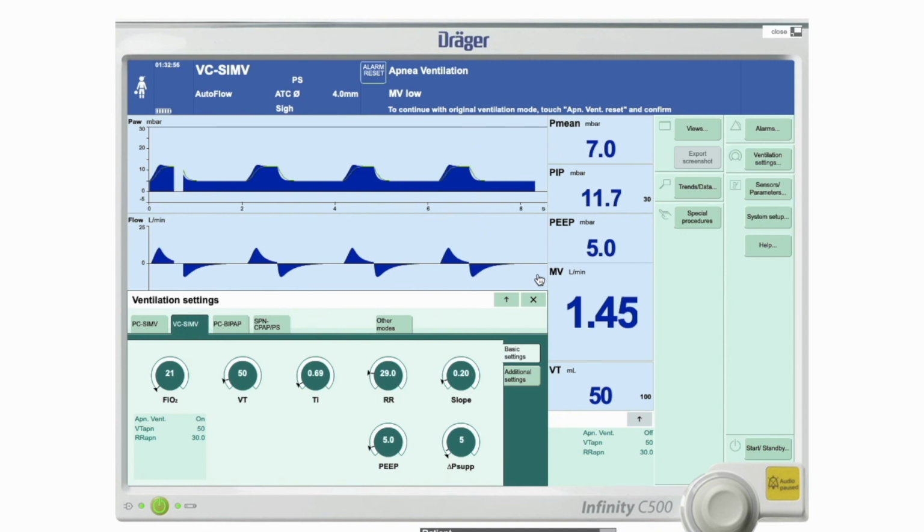So if you'd set this and the lungs were getting worse and the pressure went up and reached 25 and beyond, it would start to alarm yellow here, and it would say volume inconstant. And what that would mean is that you need to change your parameters, or bail out and do something else. I don't know, start nitric, put him on the oscillator, turn him prone, whatever you have going for you. But you need to do something. You can't just leave it as it is.